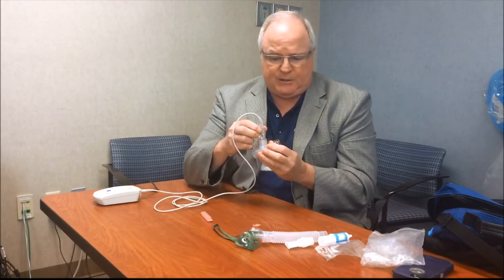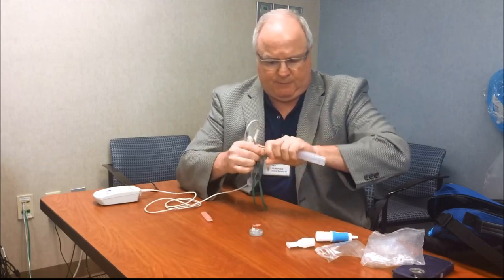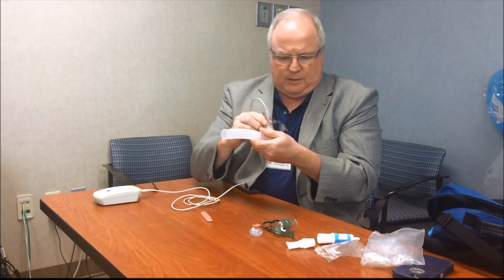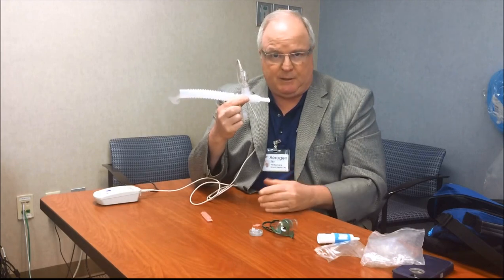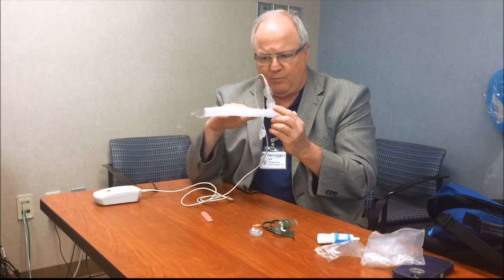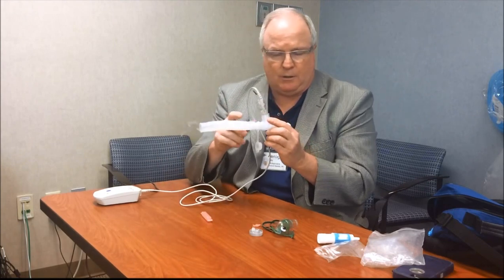So let's say, for instance, the patient is on nasal cannula. You could basically take 50 cc's of dead space, hook it up like this, drop a mouthpiece in it, and now you've got basically a T-piece treatment. You're using the dead space as a reservoir, and keep in mind there is no flow, so if the patient can't inspire, they're not really going to be able to move the aerosol at all.